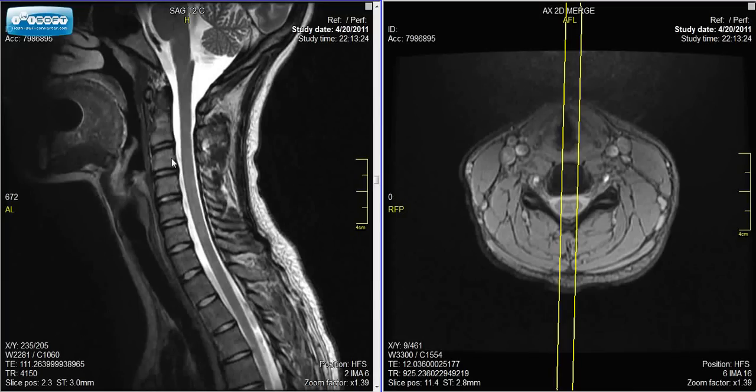Dr. Johnson here, reviewing an MRI scan of the cervical spine, or the neck.